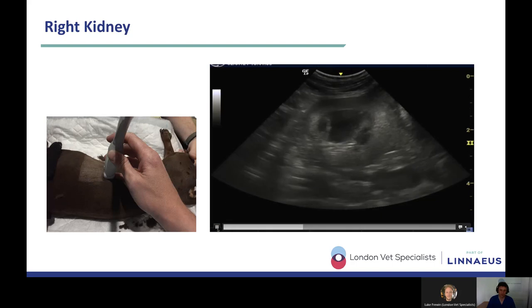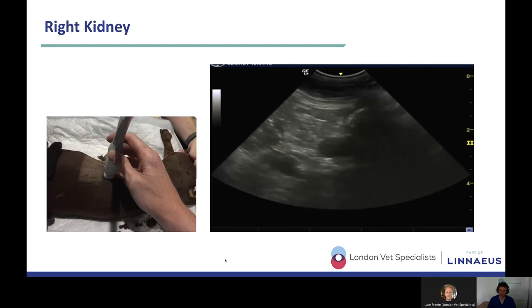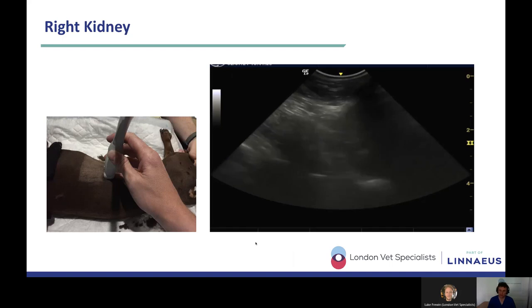And once we're happy that we've found it through our sagittal view, we're going to rotate the probe. Again, we've got a short axis view of this right kidney. And again, this is our kidney here. This is our nice bright cortex, nice dark medulla, beautiful corticomedullary definition. You can see the margins between the different renal calyces. Bright renal pelvic fat, renal pelvis is probably about here. Looks absolutely fine. So that's a nice, normal, bright kidney. And then once we've got it in short axis, we're sliding cranially, sliding caudally, making sure that we've examined all of this right kidney. Again, this is the renal pelvis here. Sometimes it can be tricky to see it. That's renal pelvis in short axis. And that looks absolutely fine. That's a nice, normal right kidney.